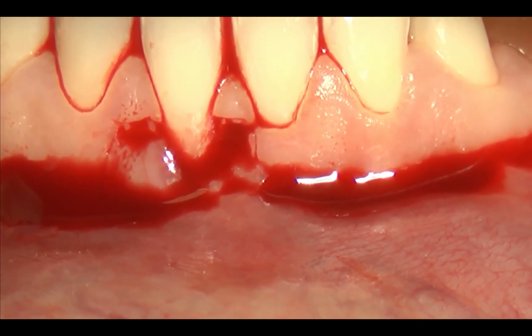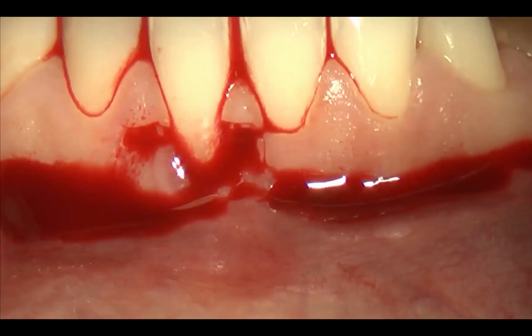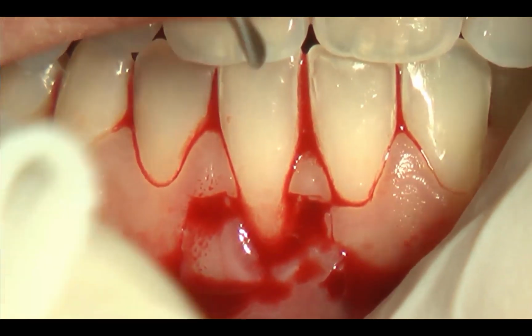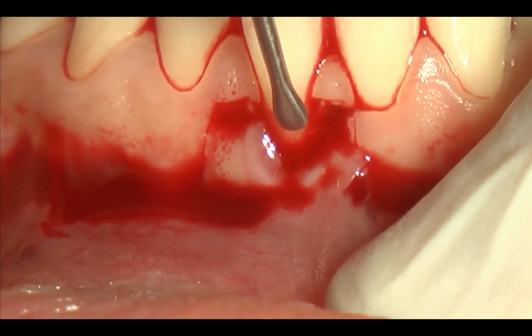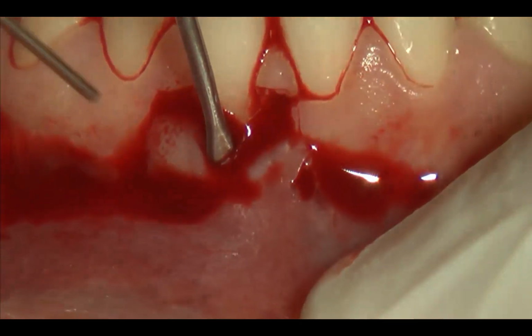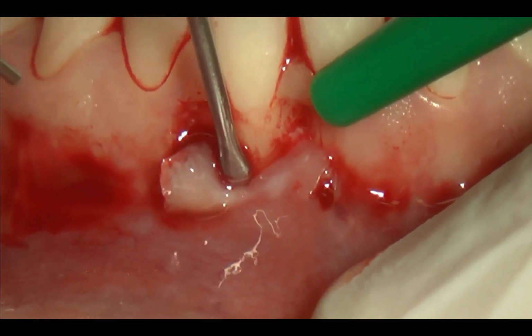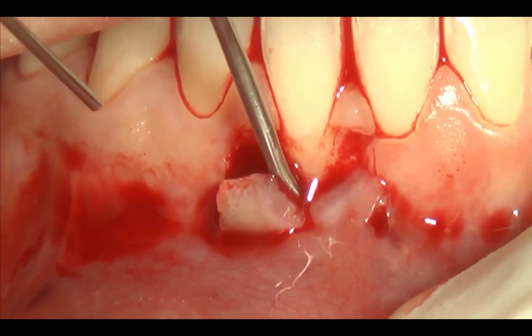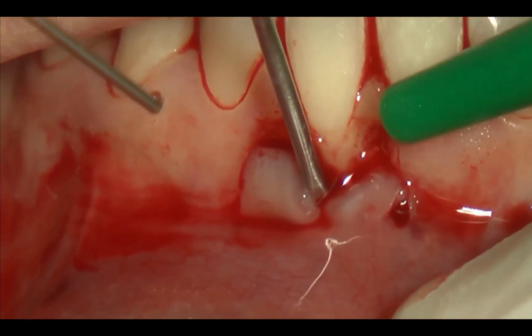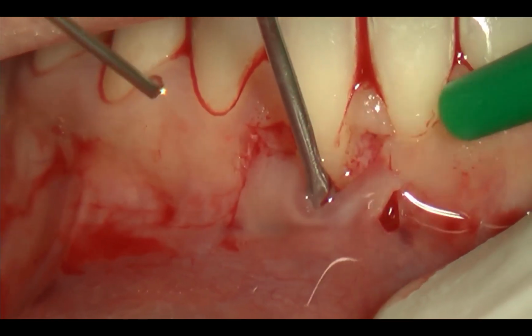So I use a very small periosteum elevator to make a full thickness elevation of the keratinized tissue, apical here, physiological. Okay. Go outside, go. There, continue, don't suction me, go away.